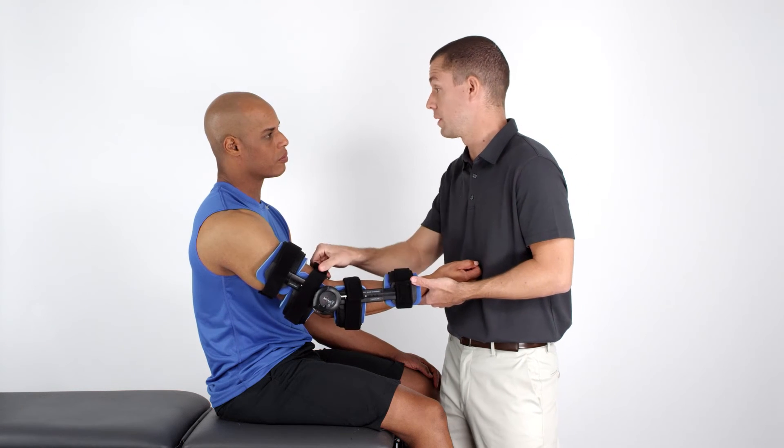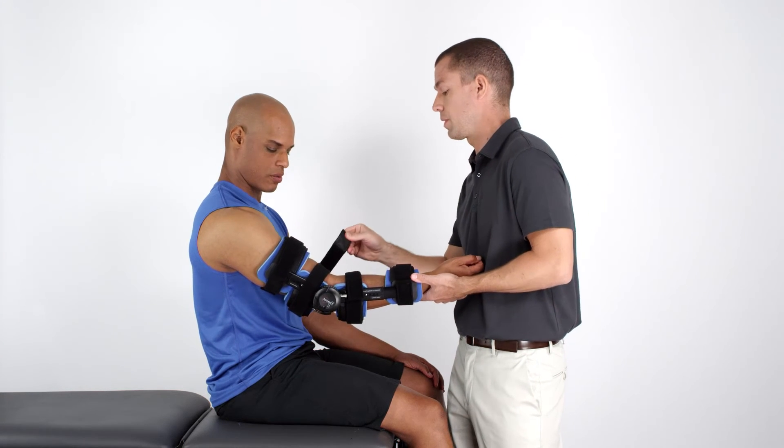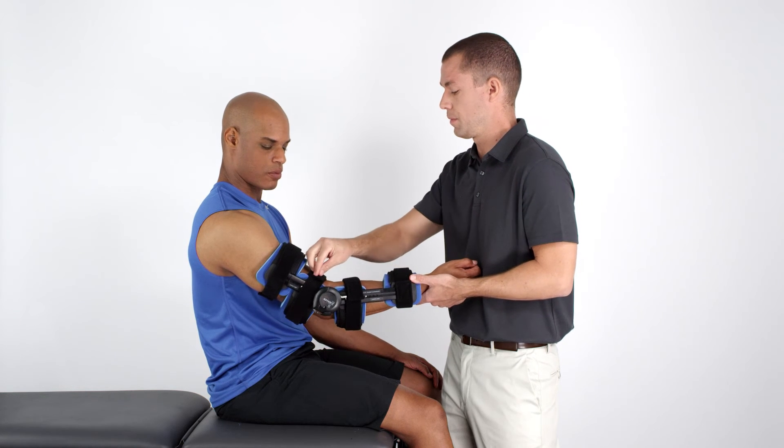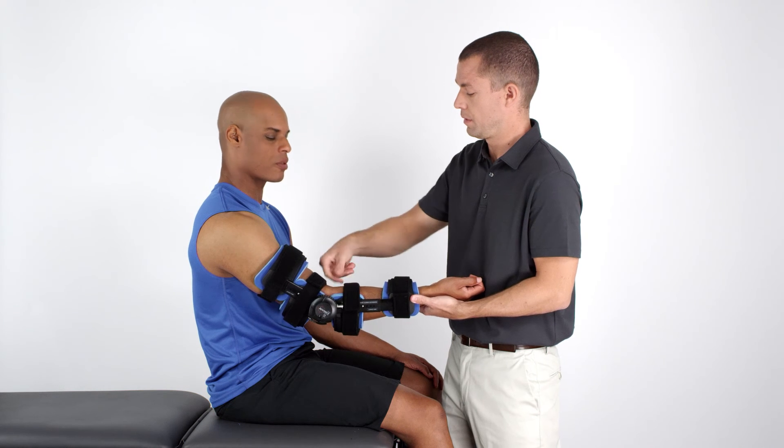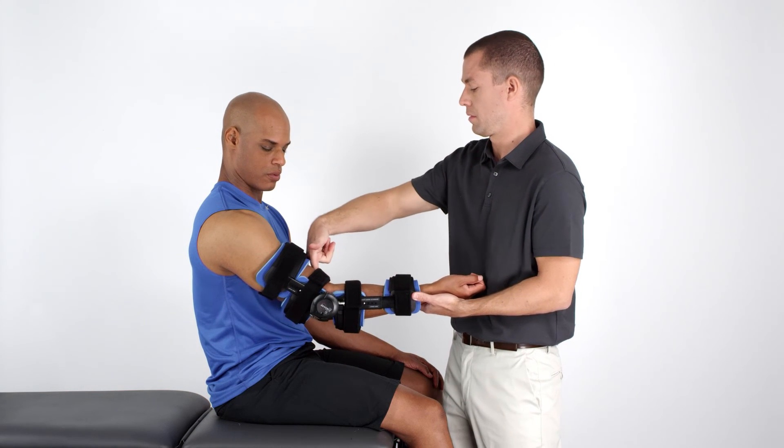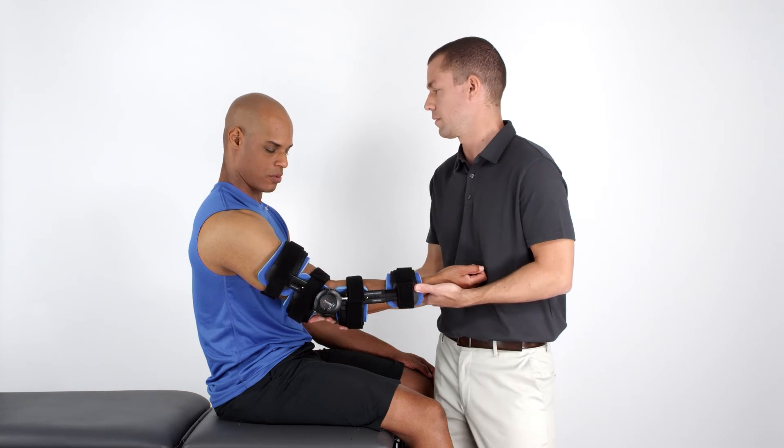These straps can be attached loosely, since their purpose is to keep the stabilizing bars in place. However, the middle straps should be snug enough to allow one finger to be inserted between the strap and the skin.